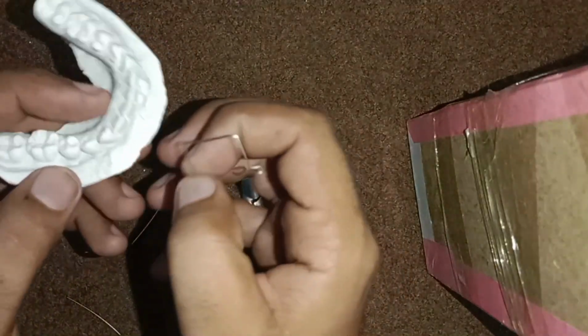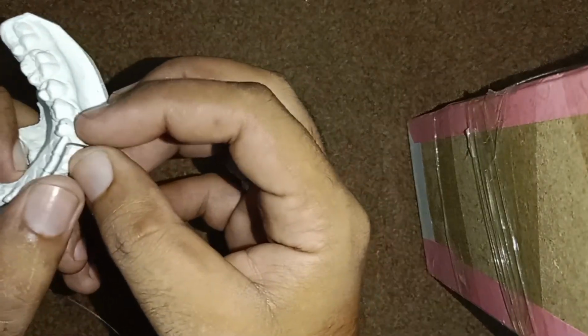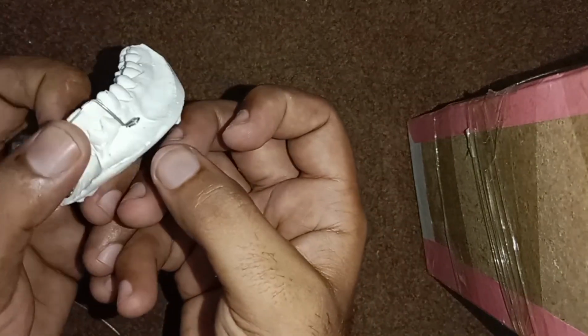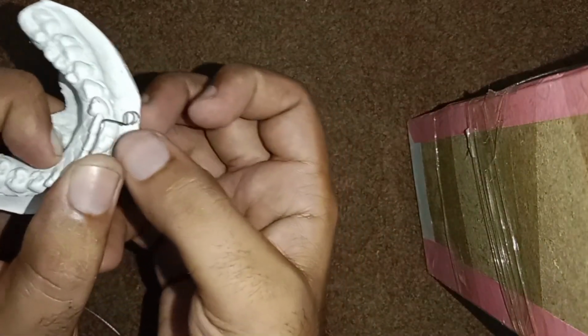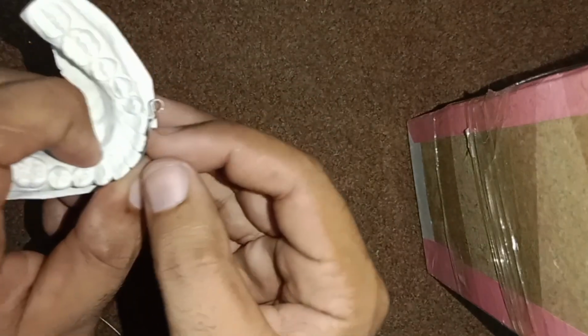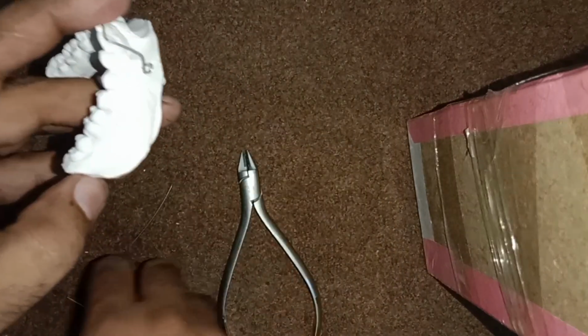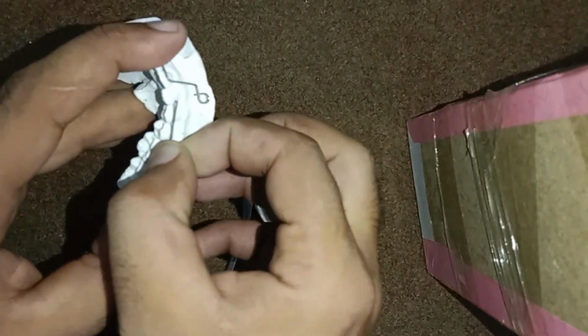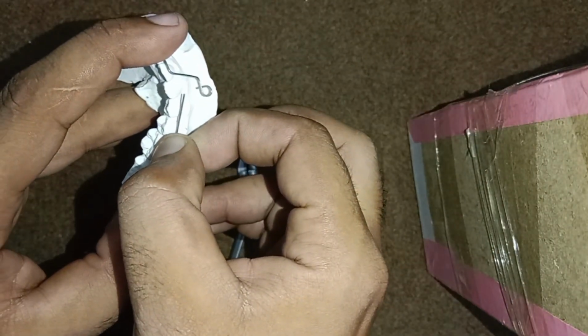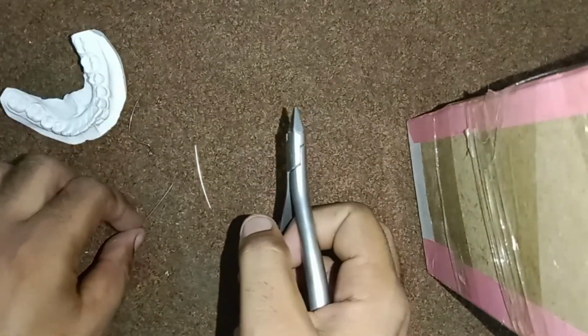We have one anterior segment which is ligated in the brackets of the 4 incisors. It has a hook in the downward direction, 6 mm down. This is the hook for activation. One piece. The second piece is ligated in the molar, 4, 5, 6, and now we'll make the third piece.